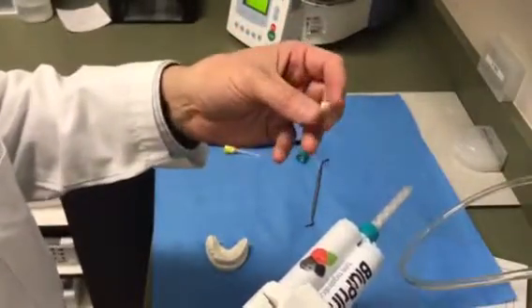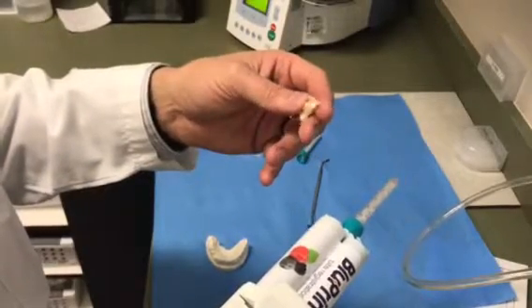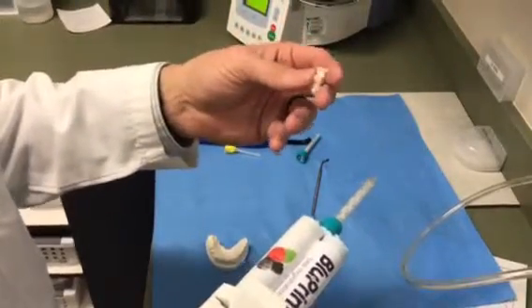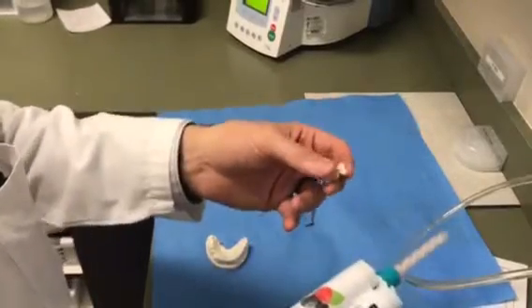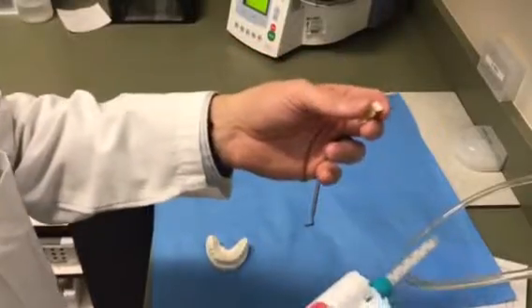So I'm trying to do this little mini impression to show them what's going on and what contours need to be filled. This is not that amazingly accurate. This works when you don't need major recontouring. So if you need just a few things filled, this can communicate that to the lab. I don't even know if they love this method, but I've used it.